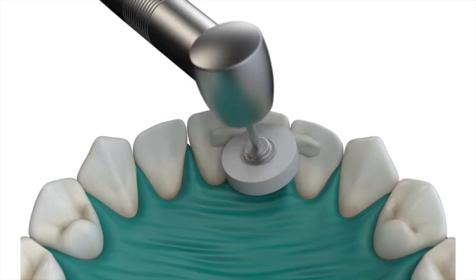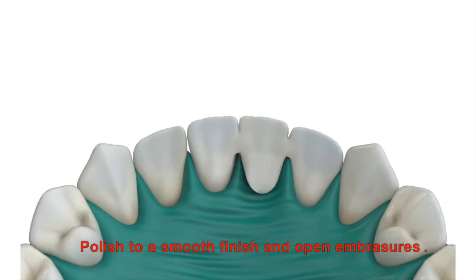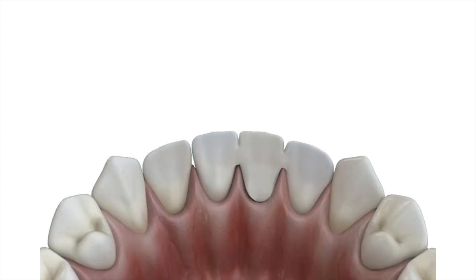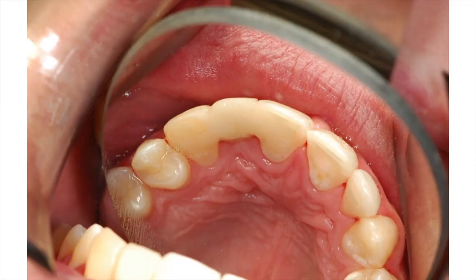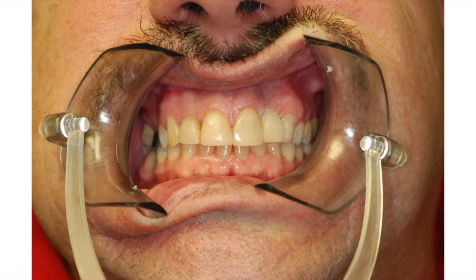It really is that simple. Take a football diamond burr or any finishing kit you have, finish off the lingual surface, and now you've created a strong, reliable, long-lasting resin bridge. I've been providing this type of service to my patients for over 30 years. I would encourage you to try this in your practice. They're successful, they're conservative, they're easy to maintain, and your patients will love them.